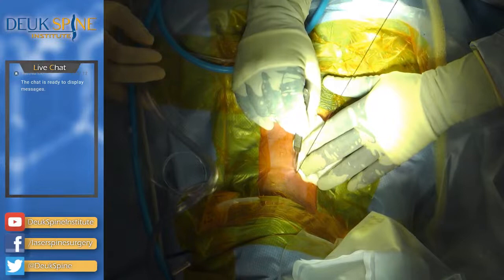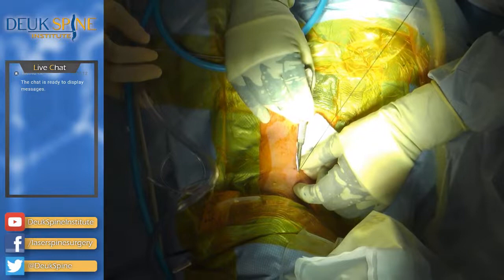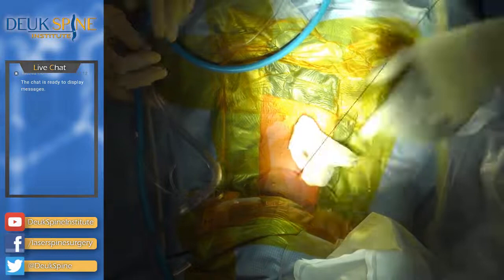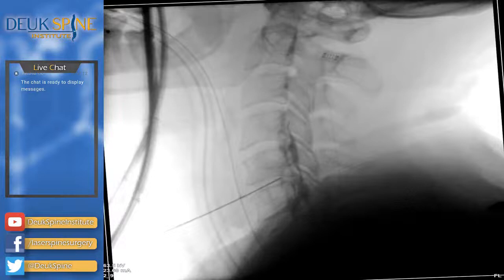The brainstem is the medulla oblongata and the midbrain and the pons. 4 millimeter incision. The medicine also contains epinephrine to narrow the little arterioles that have muscle in their walls, and basically, how's our blood pressure? That's fine. Yeah. To basically keep the blood vessels from bleeding.